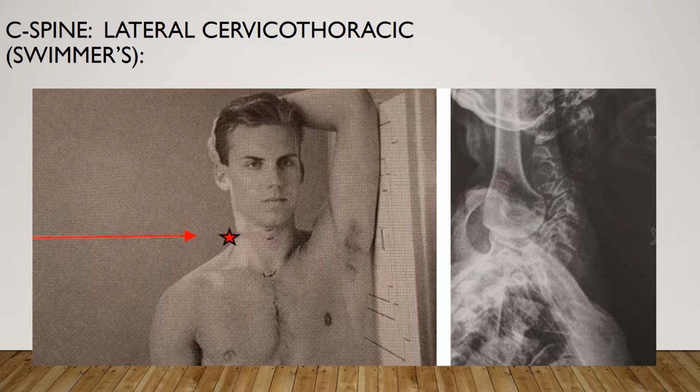For trauma patients, do not remove the cervical collar and do not move the head or neck until authorized by a physician who has evaluated the horizontal beam lateral image or the CT scan of the cervical spine. When you're looking at the image, you want to make sure that you have vertebral bodies and intervertebral disc spaces from C7 through T3. That is the minimal number you want to demonstrate.